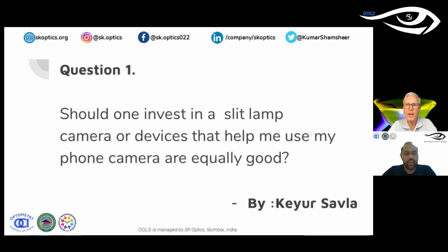For me, that was about $2,800, and my photo slit lamp was almost $20,000. So if you don't need a new slit lamp, I wouldn't necessarily invest in the photo slit lamp. You can take great pictures with your cell phone, and then spend the money on a macro camera. But if money is no object or you need a slit lamp, the camera option only adds a couple of $1,000s to it. So hope that helps.